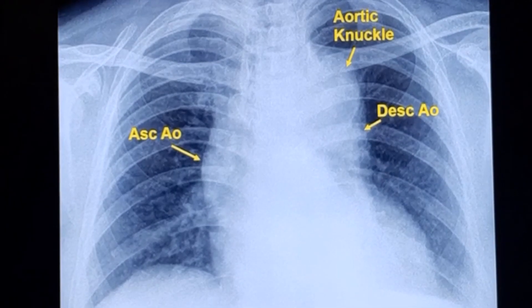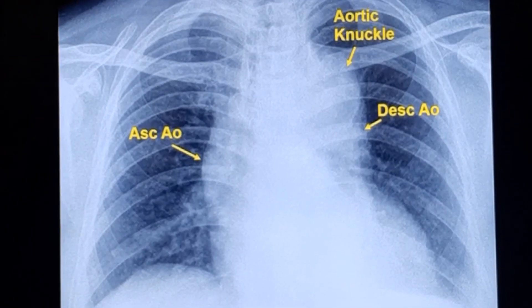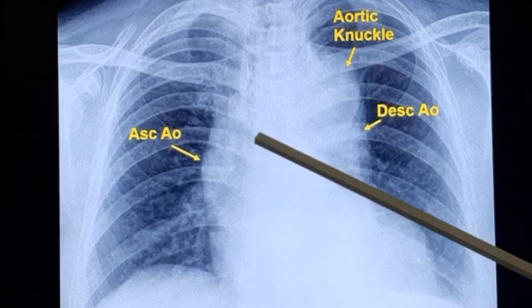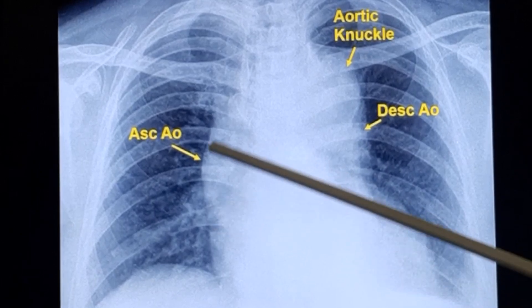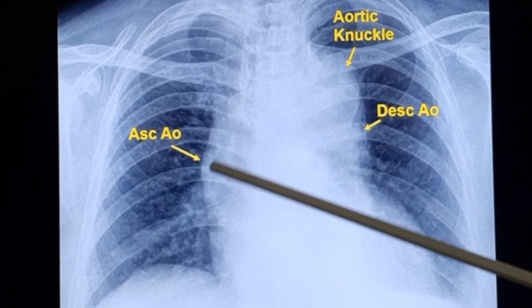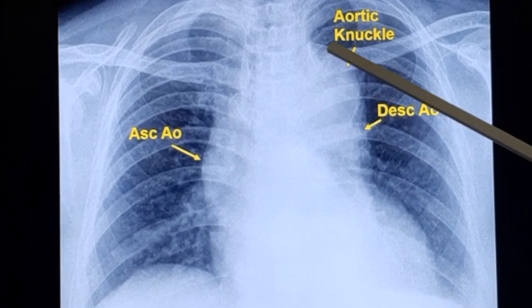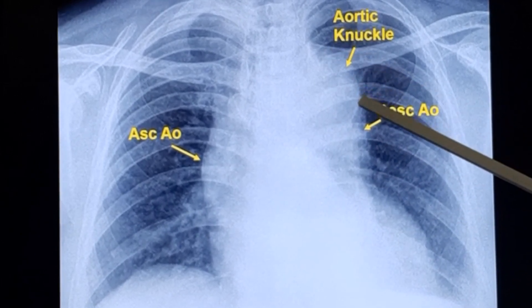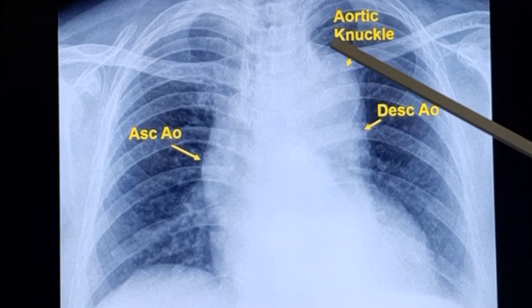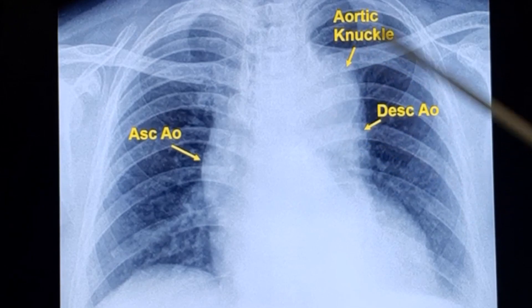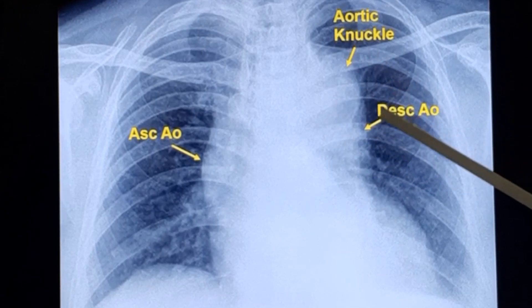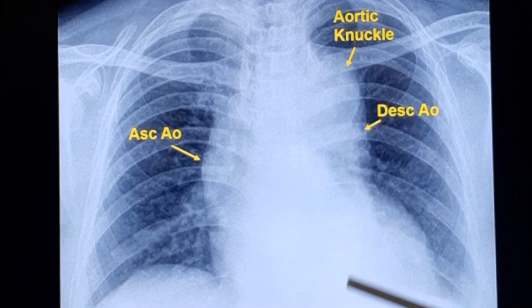This image has been labelled for convenience. The ascending aorta is labelled here, the aortic knuckle — also known as the aortic knob — and the descending aorta going down.